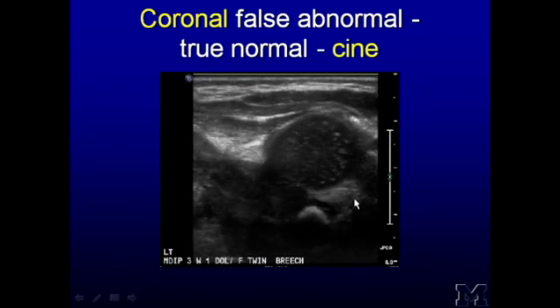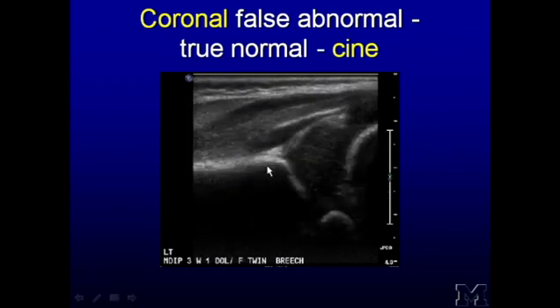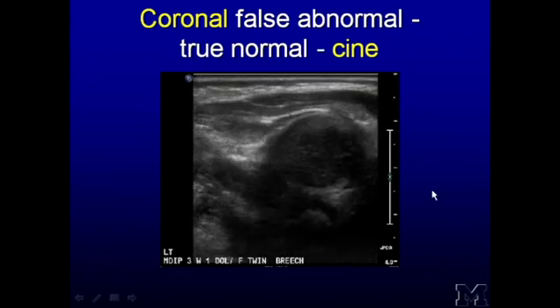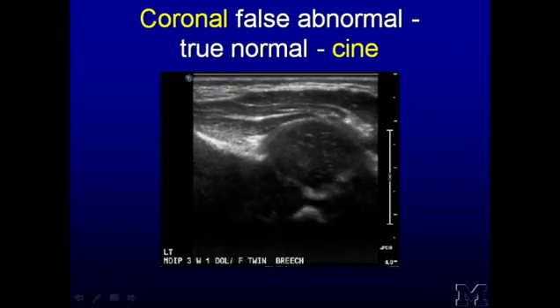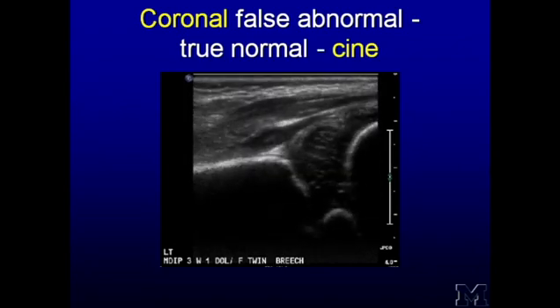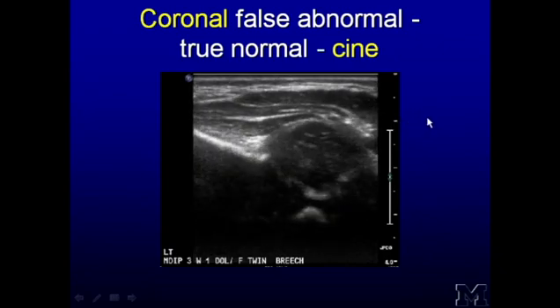so that you really are seeing the true coronal standard plane. What I'm showing you here, this was done intentionally, is that at the beginning of the loop, this is normal right there. Nice acetabular roof, lateral aspect of the ilium, the ball's in the socket. But if you have the transducer tilted or turned or transposed a little bit incorrectly, it's almost like flying a plane, which you have pitch, yaw, and roll.